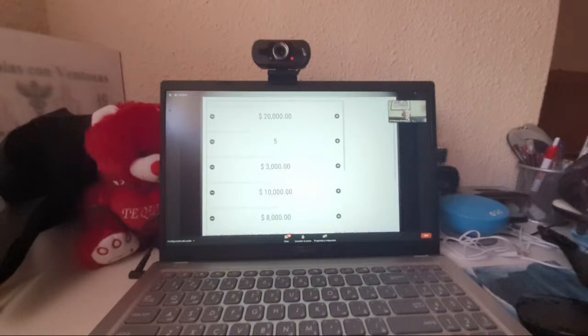You can look at this online. This is a calculator that will allow you to calculate what the cost of each reusable scope procedure is. You can vary at the top the price of the scope, and the number of scopes you have in-house. So let's say the scope costs $21,000 or $22,000. Let's say you have 6 of them in the hospital. There's a maintenance contract with these scopes, somewhere about $3,000.